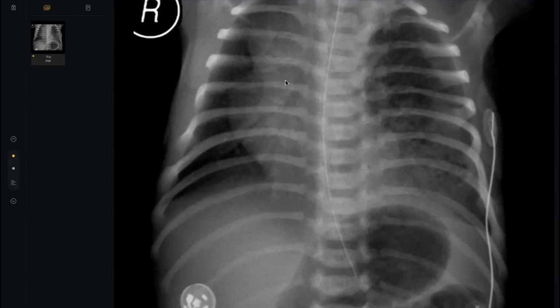Doctor, where do you think the pathology is, right or left? Left side. Okay. Which one? Upper, middle, lower zonal? It is involving the whole of the left hemithorax. No, this is the point. Request control, please. Yes, I have requested. Show me where is the pathology in the left side.